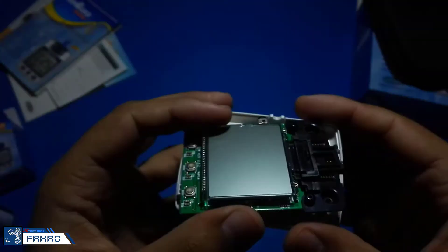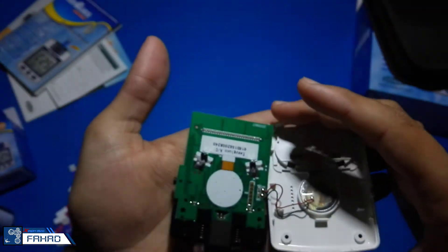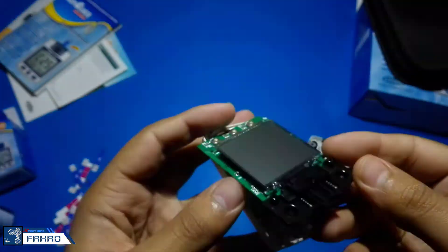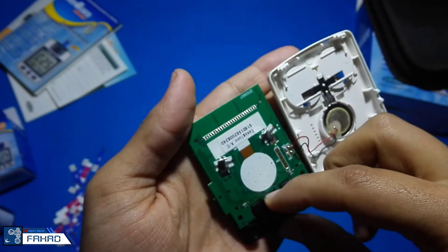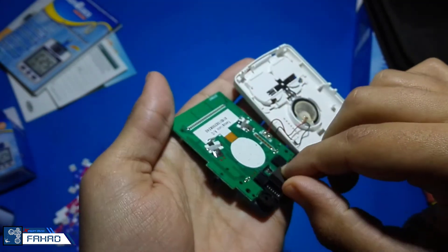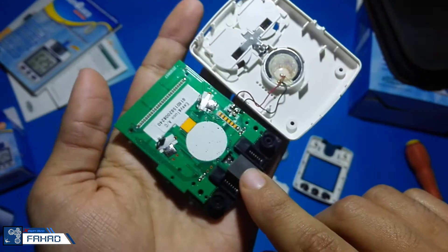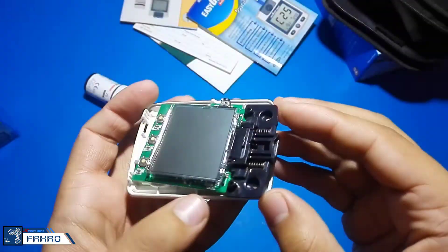I saw in an article that said the strips consist of an enzyme — when it reacts with the glucose in the blood, it forms ferrocyanide. The glucose meter measures that ferrocyanide level and gives us a reading accordingly, telling us the glucose level in the blood. So it is pretty simple — there is nothing much complex. Below that black part there are sensors which measure the ferrocyanide level and send it to the processor.